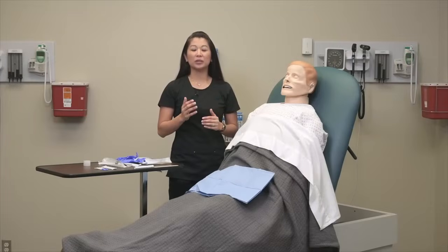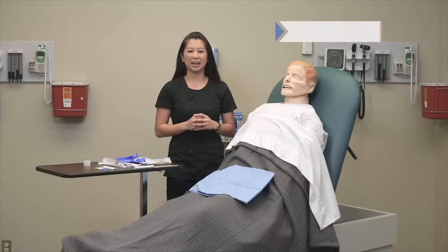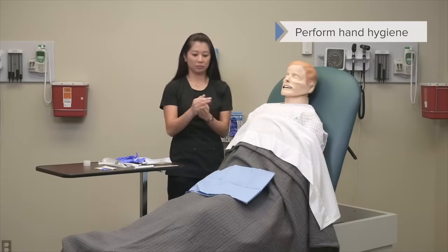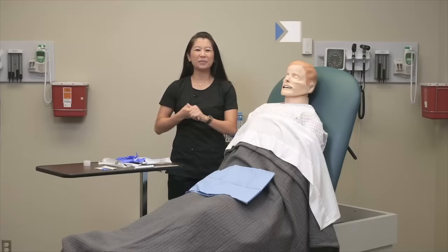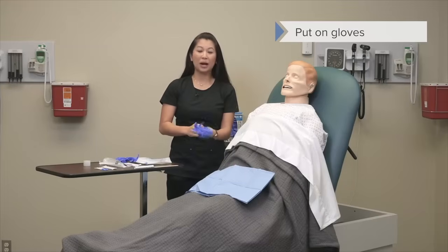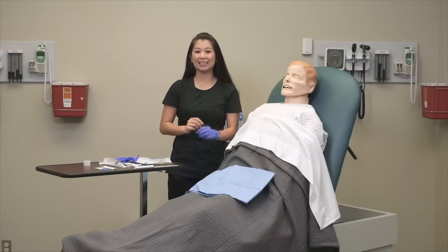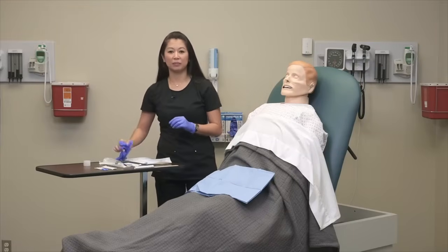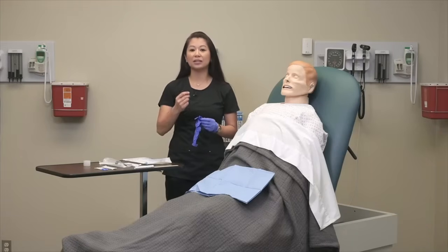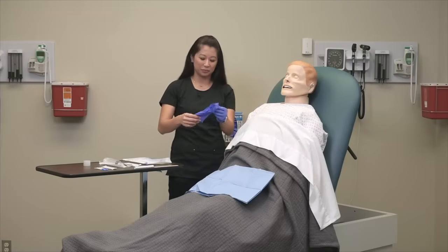I'm going to show you how to insert a nasogastric tube. So before we get started, I'm going to perform my hand hygiene. All right, and I'm going to go ahead and put on my gloves. One thing to note about nasogastric tube insertion: because we're going through the GI tract, this is not a sterile procedure. I know you may see some things that are in a package, but just note again, the GI tract is not a sterile environment. This is helpful for you to know as a student.